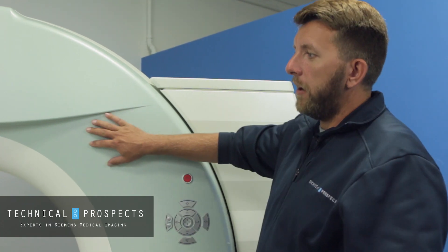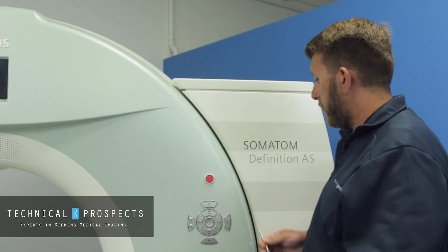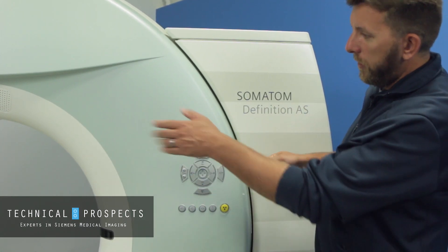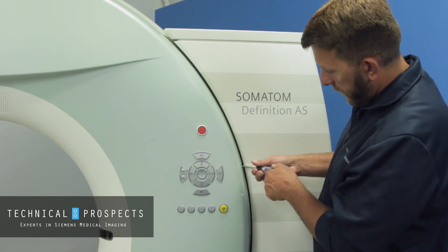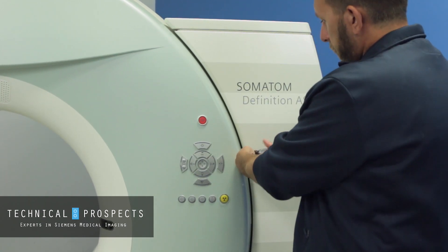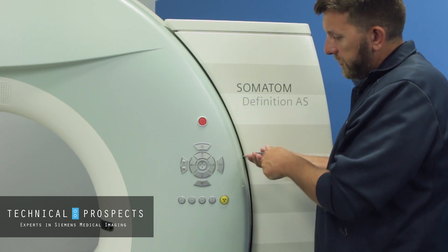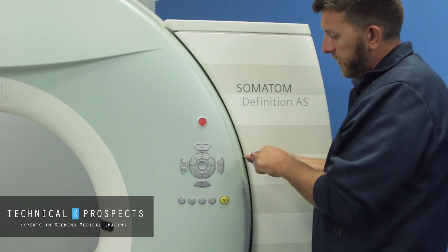To open up the top part of the cover there are two screws, both located on the sides of the control panels — one on each side. I've already loosened the one on the other side, so we'll unscrew the cover on this side. It's about six or seven turns and you'll feel it getting loose as you go.